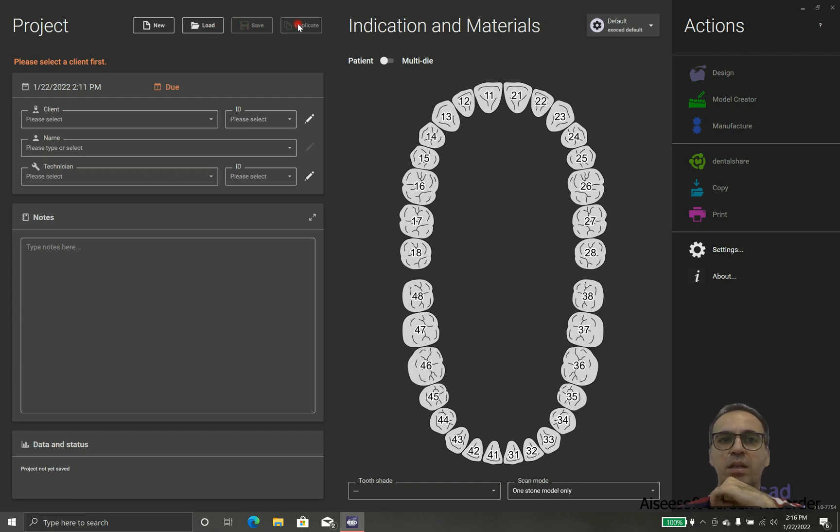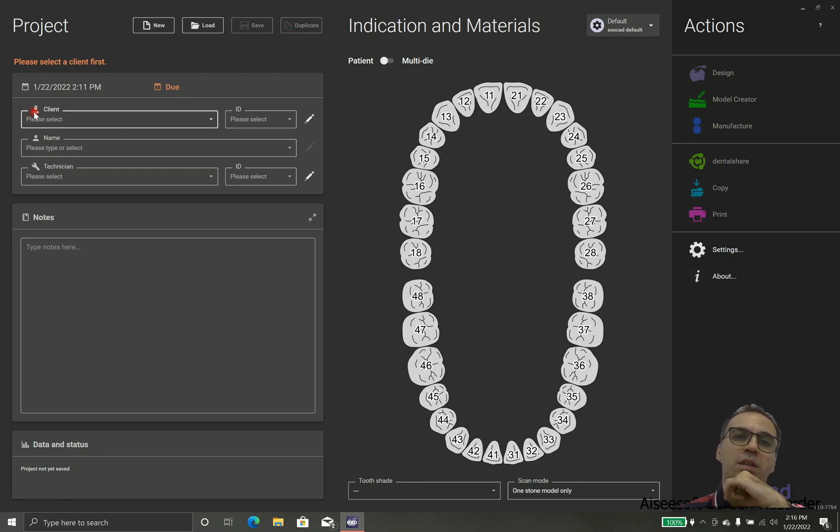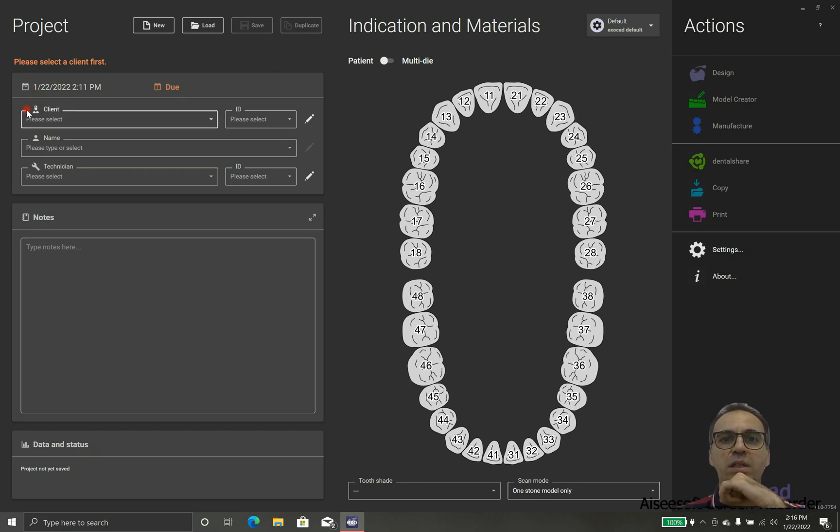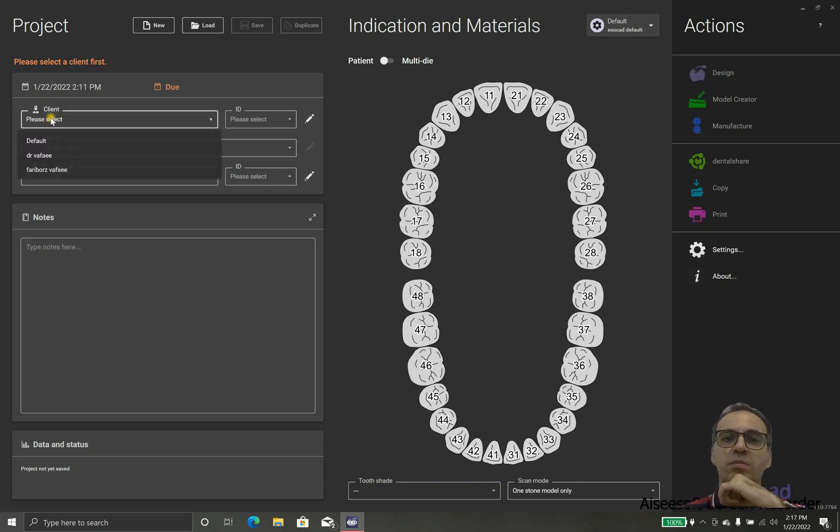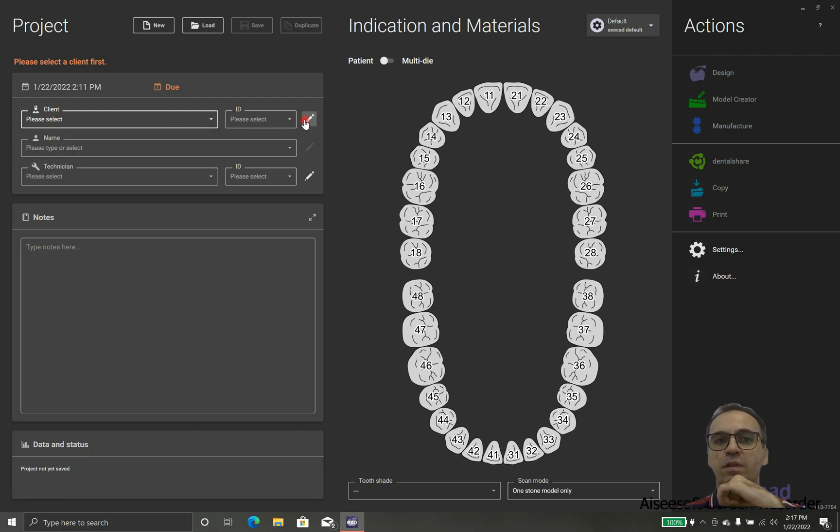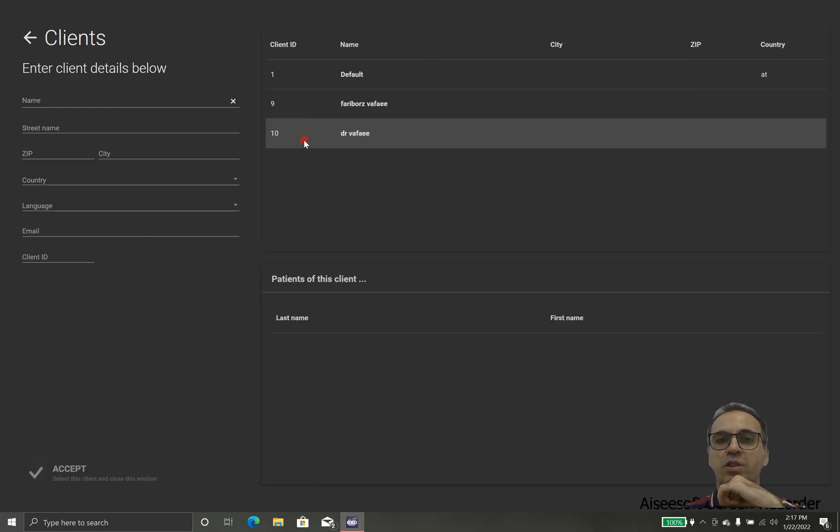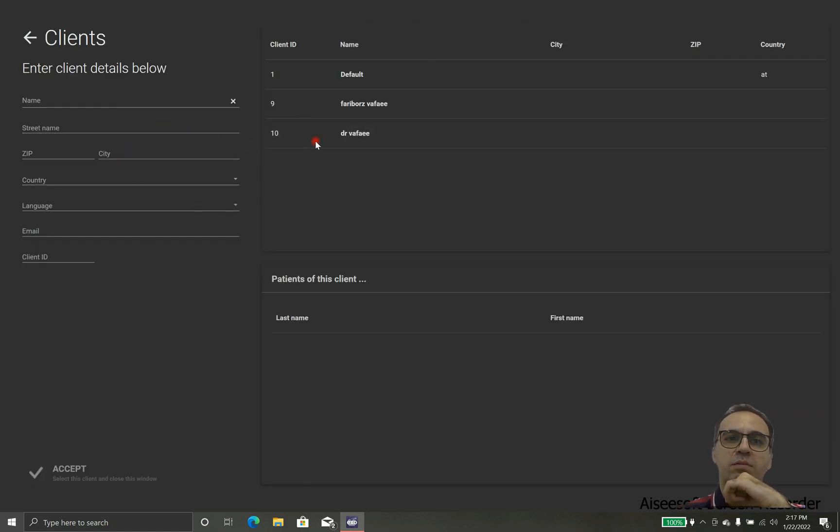First of all, we have four icons in the top: new, load, save and duplicate. New for new project, load in case that we saved it before, save when we finished, and duplicate in case that we want to duplicate something.